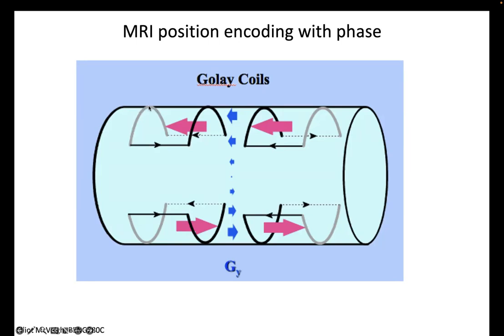And in one of those elements, I have the current going in this direction, and then the other gradient coil of current is going in this direction. And we're turning on this path. The elements that are really providing the gradient in the patient that we're going to use are this element and this element. And if you ask, well, what's happening here?